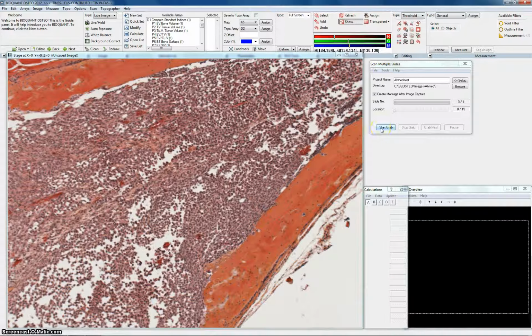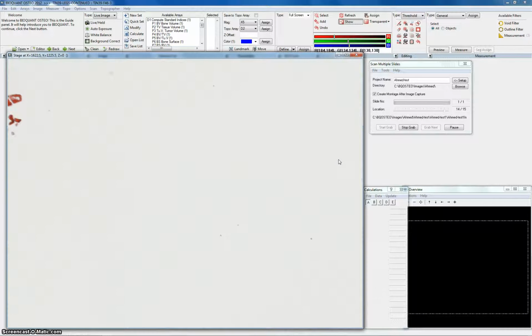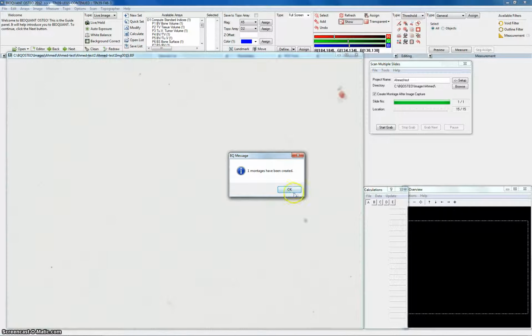It takes about a second or so for each frame to be taken, but please don't scan like 60 or 70 frames at one time, because usually it freezes with these high numbers. If you want to count the osteoblasts, for example, and you're scanning using the 20x, then to cover the exact same areas that we just covered, instead of 15 frames you probably need 60 to 80 frames. But I don't think you'd need this whole area. Maybe you just need a couple of frames in the center.